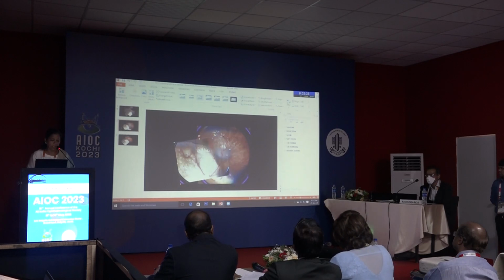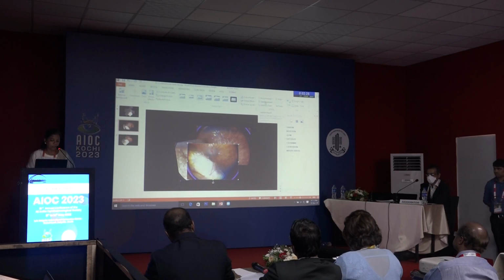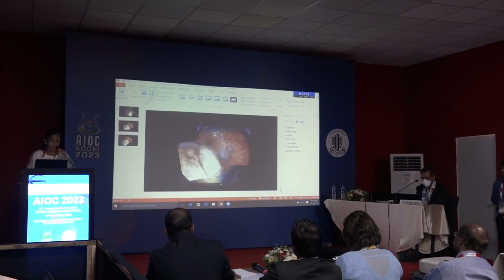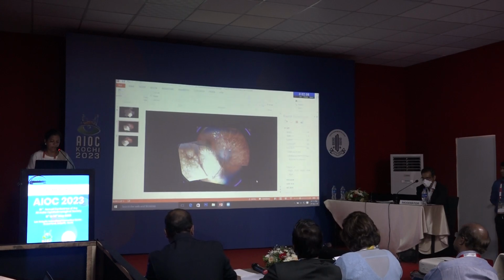To check whether the alignment is proper or not, it is brought forward. Since the alignment is not proper, the central image is further moved here and there, with to and fro movements, and then the backward image is rotated to align the vessels. Thus, the montage is complete.